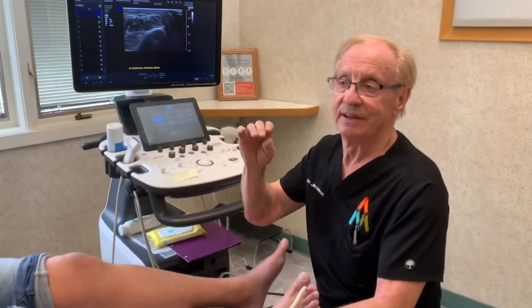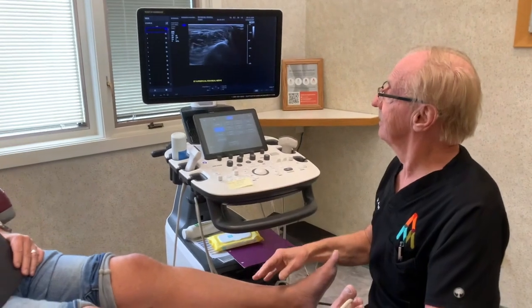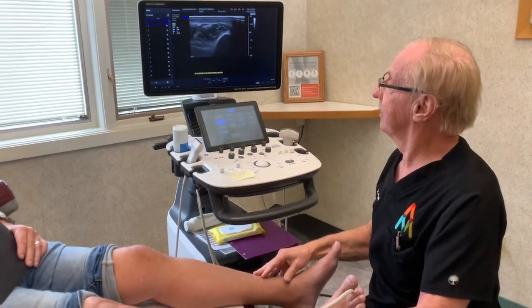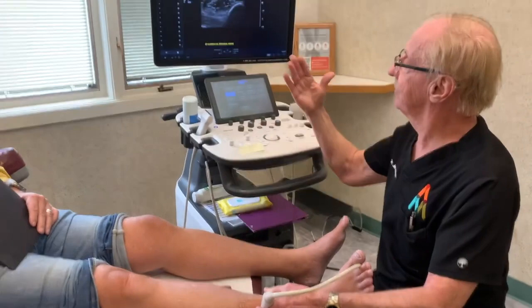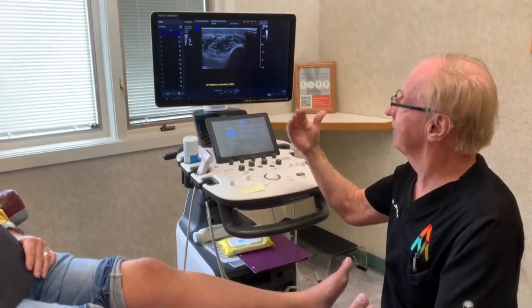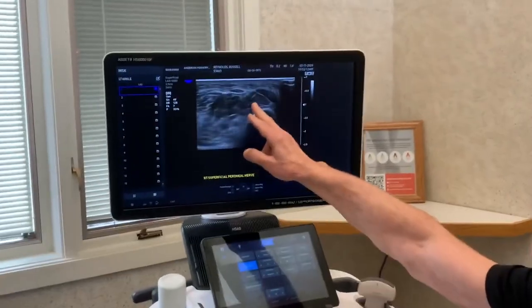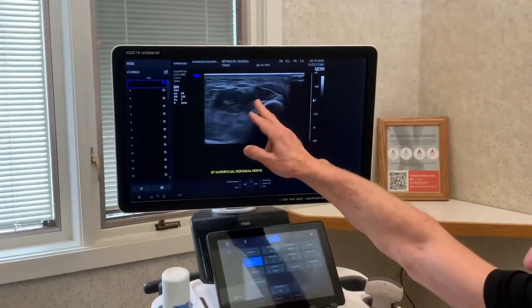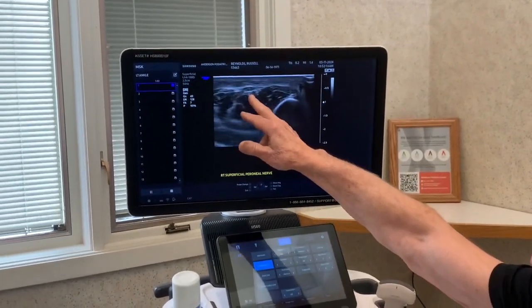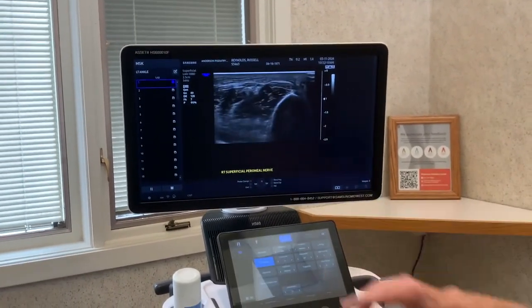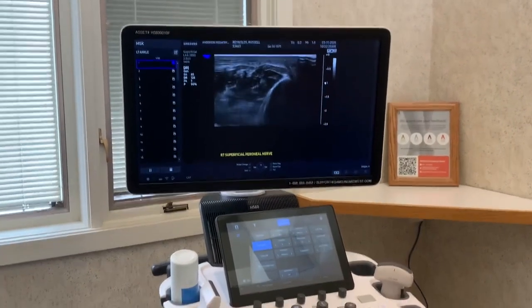I'm going to show you something fun. If you could move your foot up and down gently — there's the nerve. You can see all that surrounding tissue that's muscle, and there's the nerve sitting right above the muscle. So relax now.